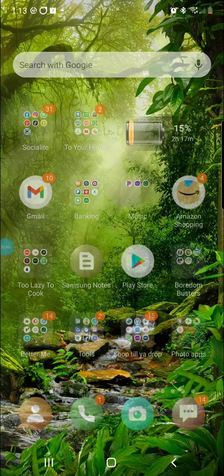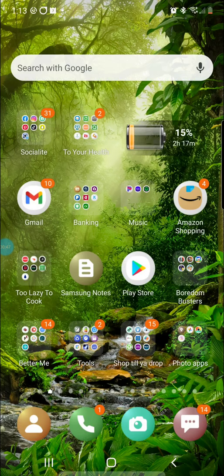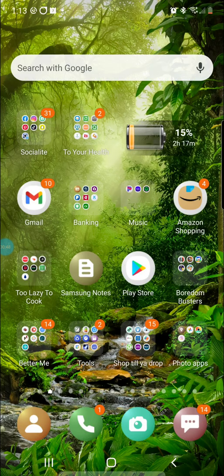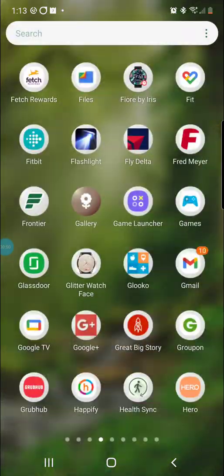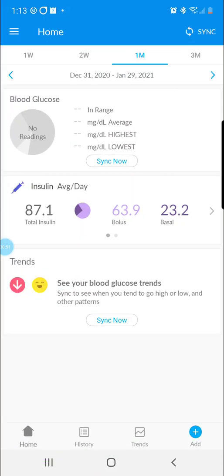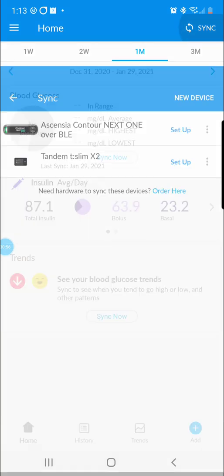Step one is going to be to open the Gluco mobile app on your Android. From the home screen, you're going to click the sync button in the top right corner.